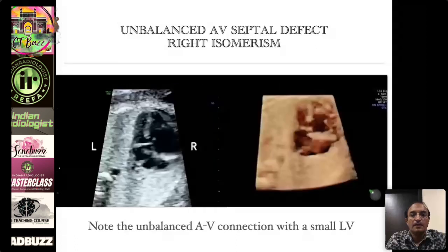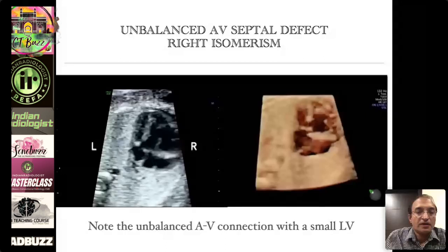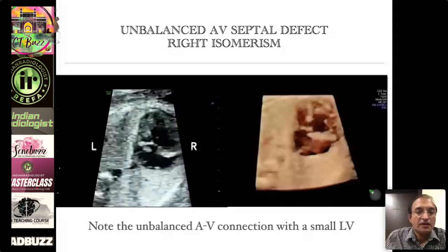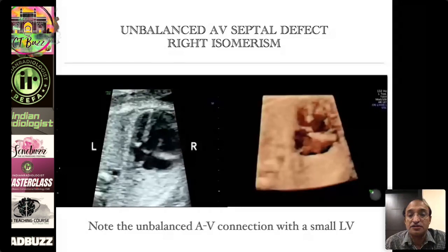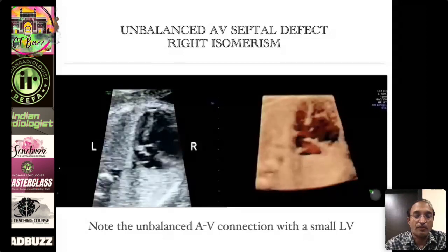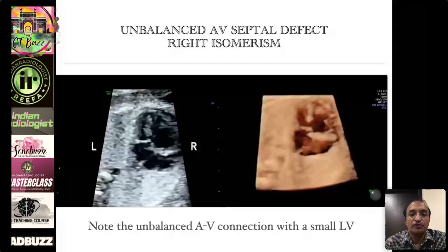The entity I just showed was a balanced type of AV septal defect, where the two ventricles were equal sized. Now look at this type of AV septal defect — the valve is predominantly opening into the right ventricle, which is large, while the ventricle on the left side is really small. This should be termed an unbalanced type of AV septal defect with a small LV.